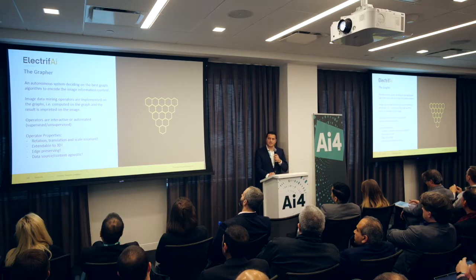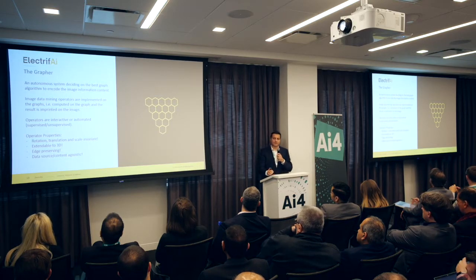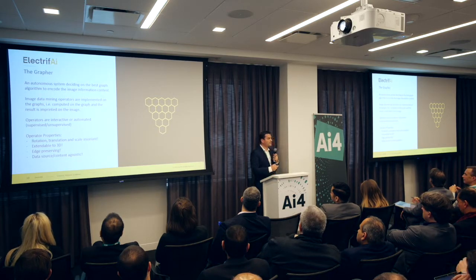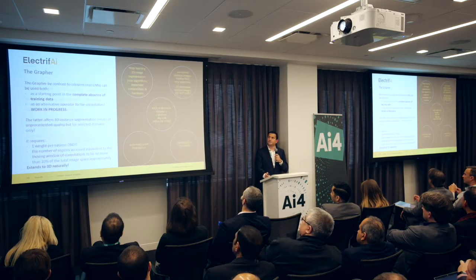We want them to be edge preserving, and we want the data structure to be data source or content agnostic. So it doesn't matter if it's MRI images or CT scans or you name it, we want the same technology to be equally applicable and transferable to all those domains.